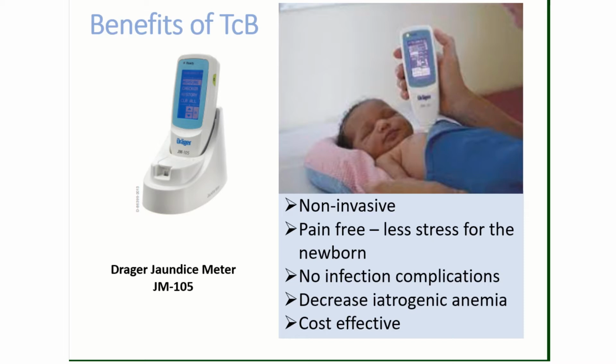While we only require a small amount of blood to run a bilirubin test, it's a lot of blood for a newborn. On the left of the screen, you'll see a photo of our actual meter that we will be using in its docking station.